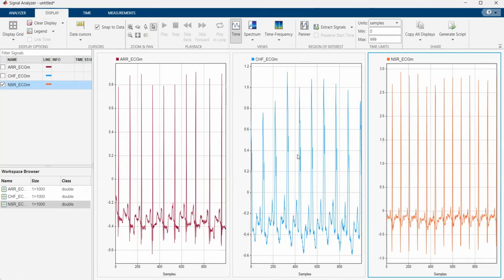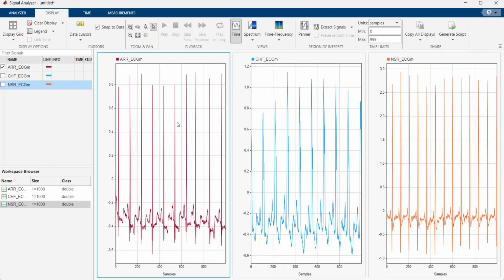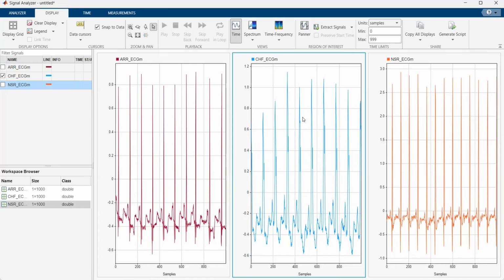Now, we have come to a point where we are talking about feature extraction. In order to train a machine learning classifier or a neural network, we have to extract features from the raw data. And when they are signals, and if we are not the domain experts, so I am trying to keep everything in layman's language so everybody can understand this. A lot of theory is not going to help us over here. If I compare all these three signals, I am able to understand, okay, they are not the same, but fine, because we have explored them.